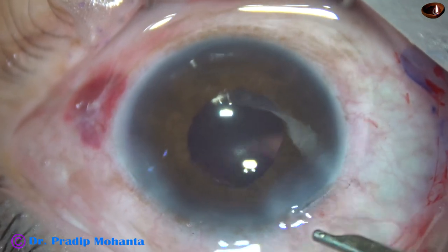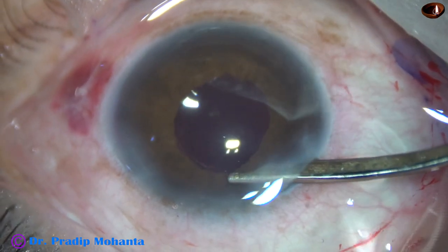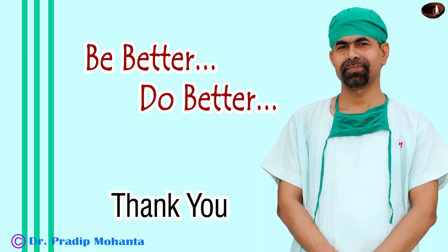The main wound was constructed in such a way that it will not require any hydration, though there is positive vitreous pressure and vitreous upthrust. Check the integrity of the wounds and close the case. Thank you very much for your attention — hope this video will help you in developing your surgical skills. Always take on challenging cases, particularly when you have a senior person around you who can help out in case of difficulties. Raise the bar of your skill, be a great surgeon, and serve your patients with love, respect, compassion, and great surgical skills.